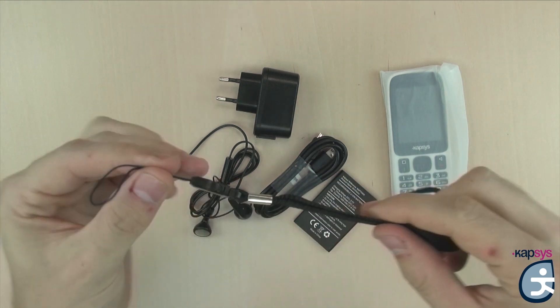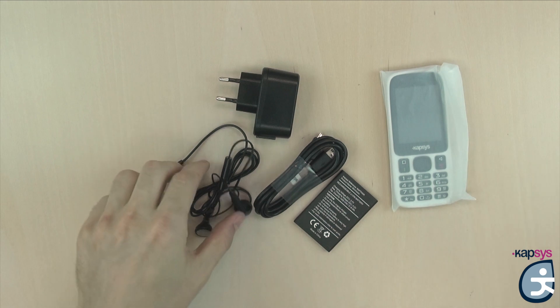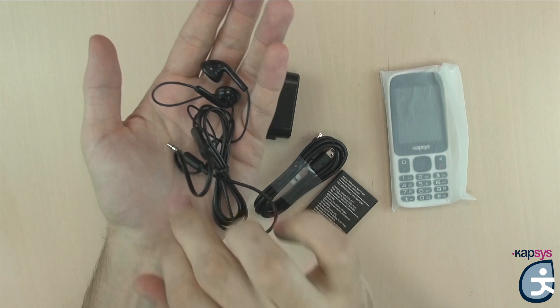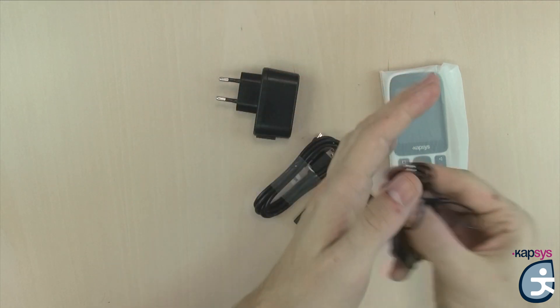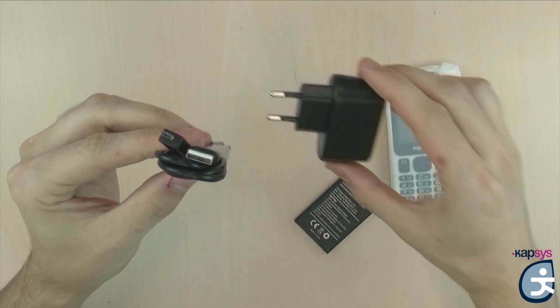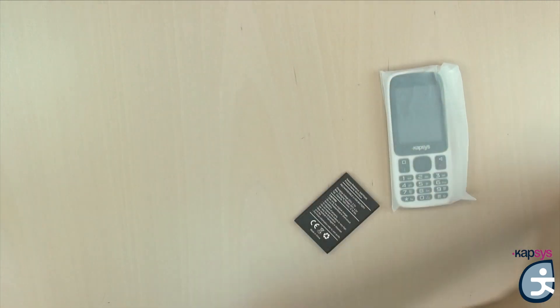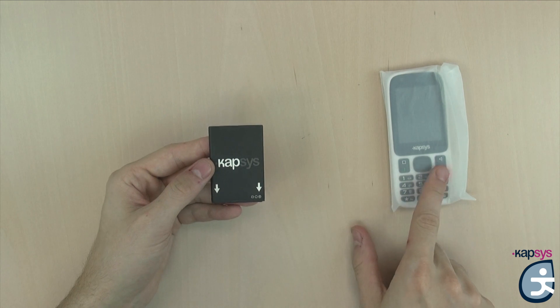First, a neck strap that will allow you to hang the phone and prevent it from falling. Then, a pair of earphones that will serve as a hands-free kit for calls, for the FM radio, or simply so that others do not hear the voice synthesis of the phone. Then we have the micro-USB cable and the AC charger that will allow you to charge the phone. And finally, the phone battery.